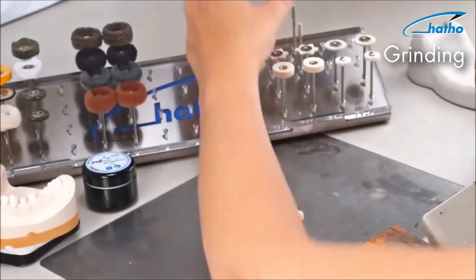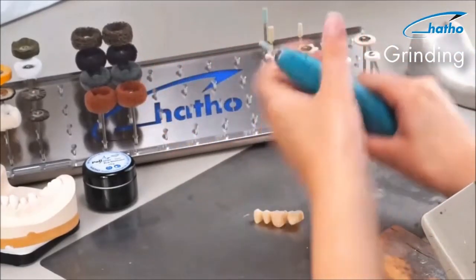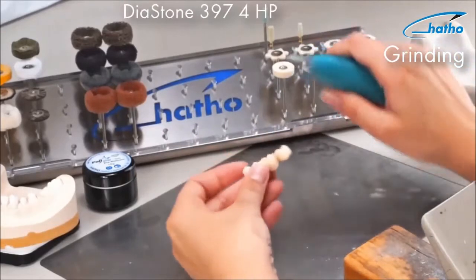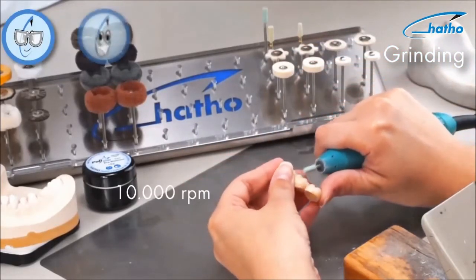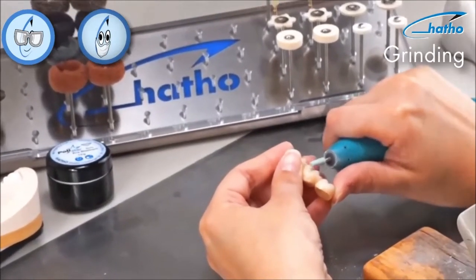Working on a zircon bridge veneered with ceramic, we recommend our coarse diamond abrasive grinder. This green color-coded coarse diastone is used at a speed of 10,000 rpm. This allows one to achieve the best abrasive grinding without overheating the ceramic.